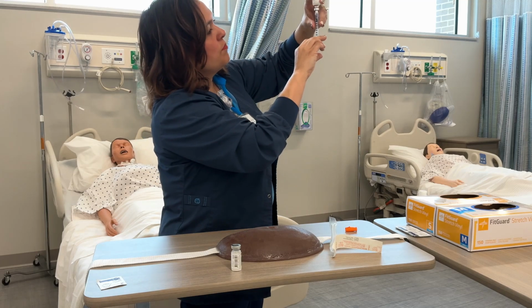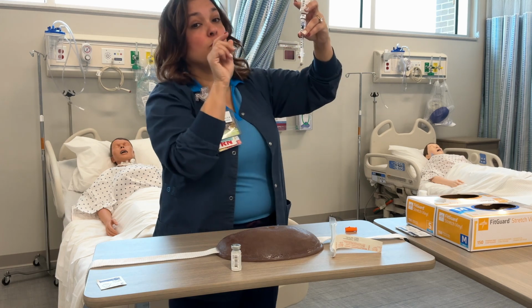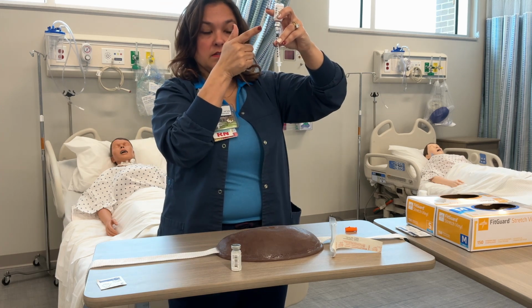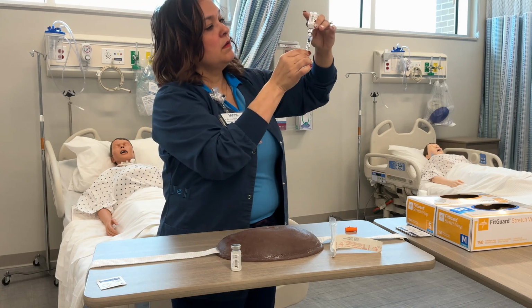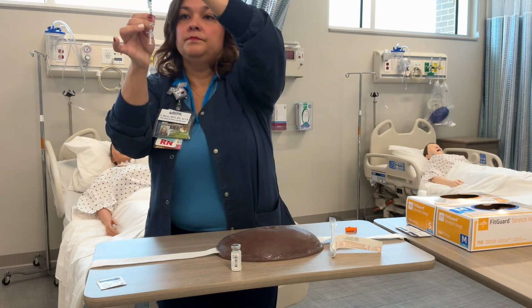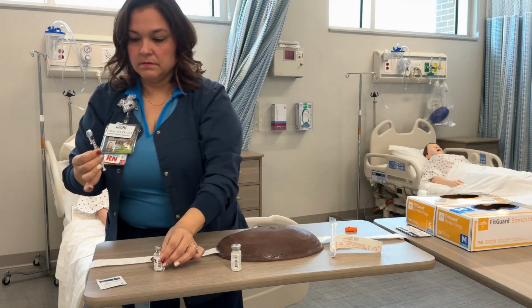I always go below, like more than 10, and I just push it up a little bit to the 10 marker. You can only do that with the regular insulin. You cannot do that with your cloudy. Okay, so I'm going to come over and verify this. She has 10 units, absolutely. Now she's going to withdraw it.